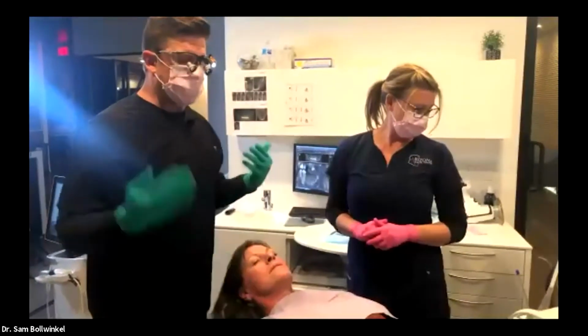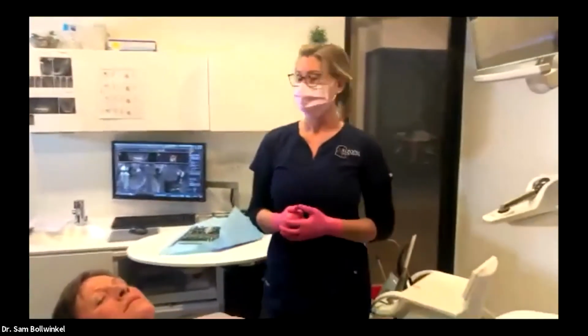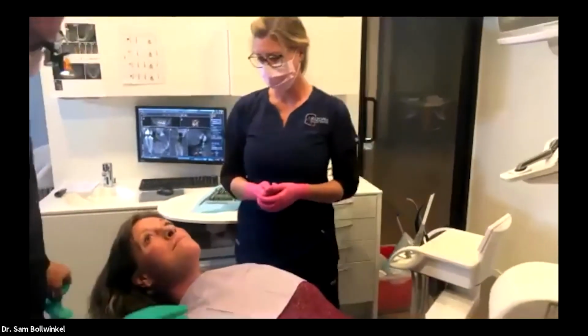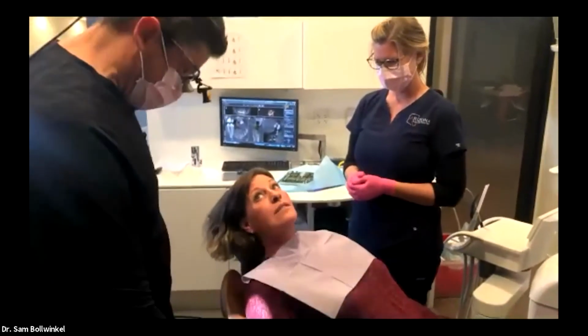So I'm going to step out. We're going to do some narration. We'll do some summarizing. Kim's going to get some X-rays for me. Let me sit up the patient. Carrie, you did awesome. Nice job. Thank you so much. Your ideal patient. He's fantastic.